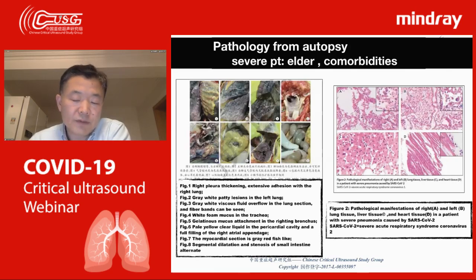So if you see the CT scan, or you combine this kind of information with images like CT scan, X-ray, or even lung ultrasound, you can think about what kind of ideas this gives you. So maybe in the first part you think of B lines or even A lines.